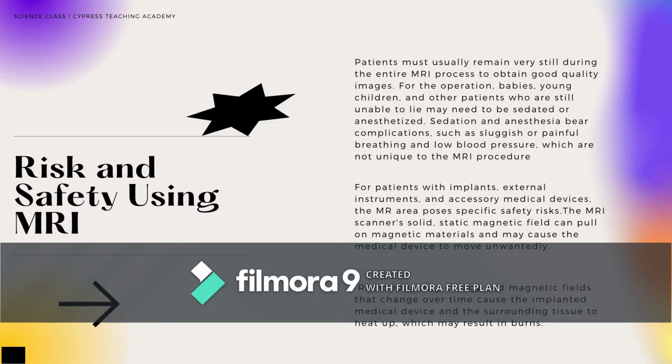Risk and safety using MRI. Patients must usually remain very still during the entire MRI process to obtain good quality images. For the operation, babies, young children and other patients who are unable to lie still may need to be sedated or anesthetized. Sedation and anesthesia bear complications such as sluggish or painful breathing and low blood pressure, which are not unique to the MRI procedure.